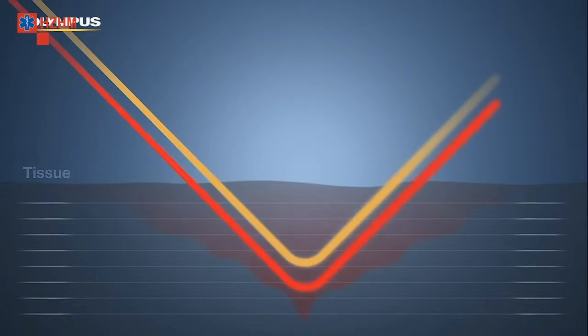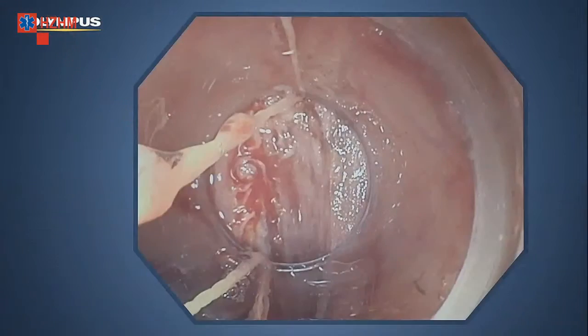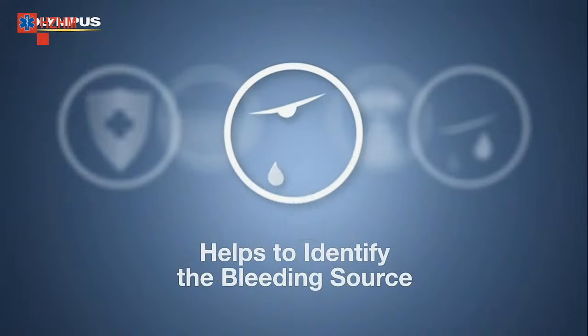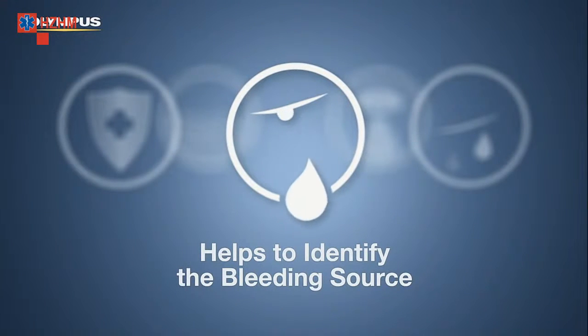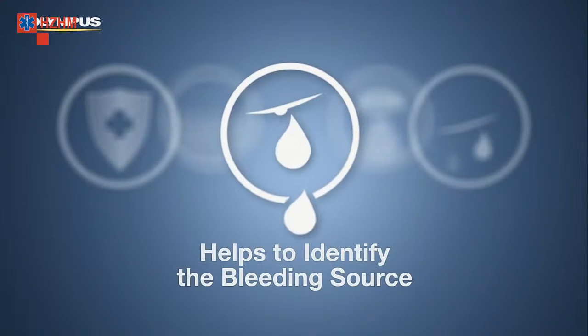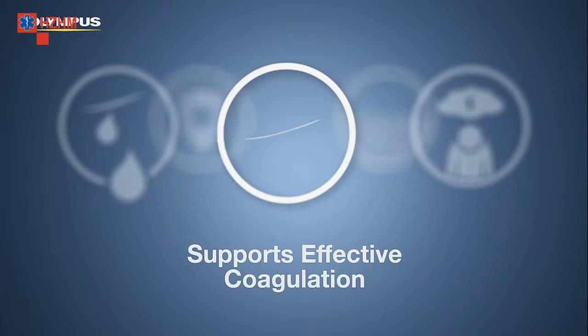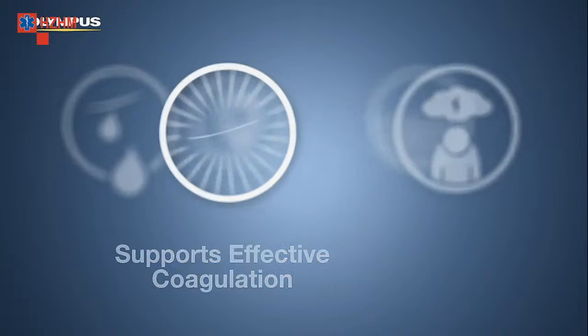If the amber light hits a bleeding point at which the blood concentration is very high, the amber light is strongly absorbed. The bleeding point appears darker and is therefore more visible. RDI thus helps to efficiently identify the bleeding source during endoscopic resections. This supports clinicians to coagulate bleeding vessels quicker and easier.